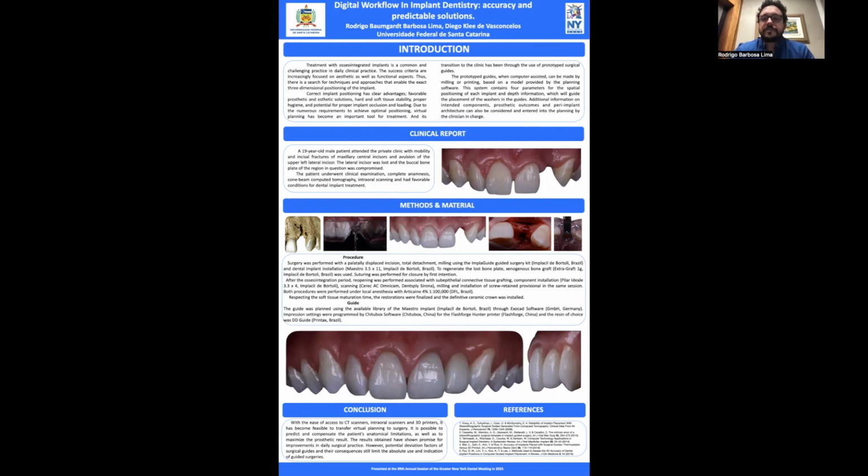After the osseointegration period, reopening was performed, associated with subepithelial connective tissue grafting, abutment insertion, scanning, milling, and installation of a screw-retained provisional. All this in the same session.